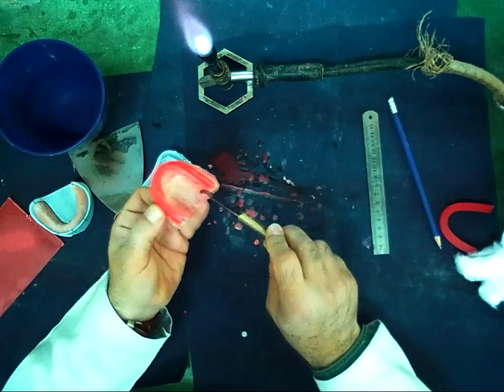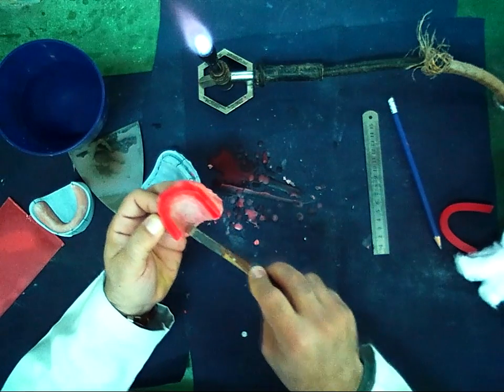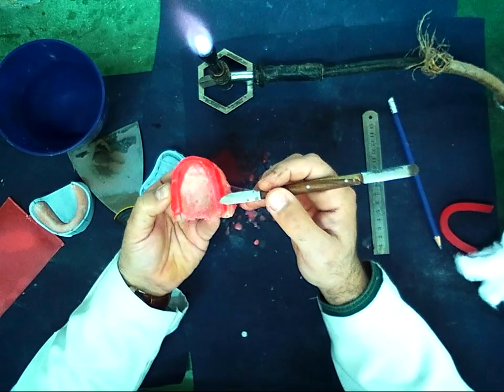Now I should fill the space between the wax and the record base on the palatal side, and then I should make the increase in the width from 4 to 7 gradual.